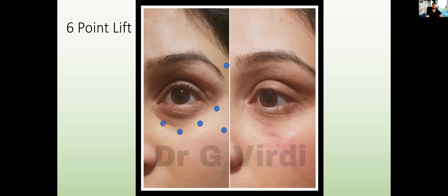So do keep anatomy in your mind, but once you're on periosteum, be sure to aspirate if you do, and inject very small quantities. Now, the angular artery and the vein are near the base or the junction between the nose and the face. So as you can see, this injection is still a fair distance away from that area. And once I've left a little bolus here, what I would do with my finger? I will massage the product medially.